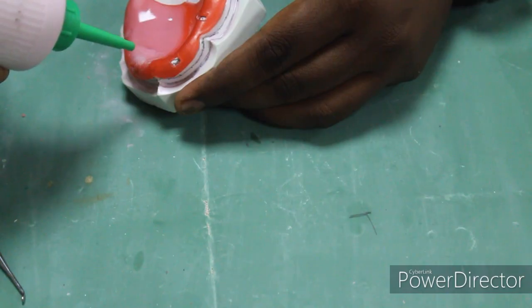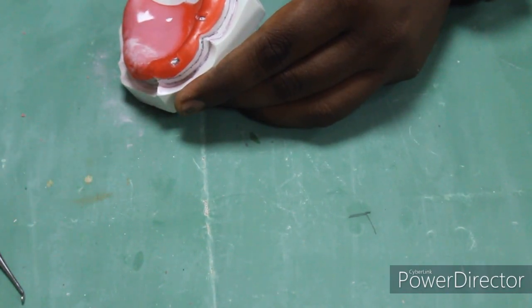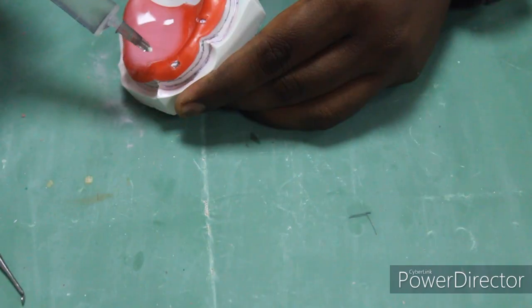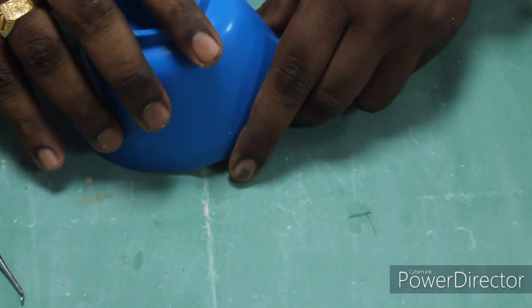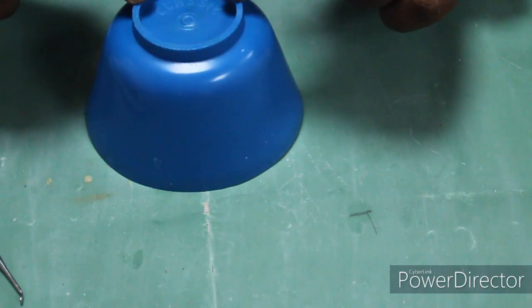In order to prevent porosity on the surface of this special tray, we have to do one technique. We can cover this surface of the cast with a rubber bowl. Why? Because the monomer is a volatile substance.